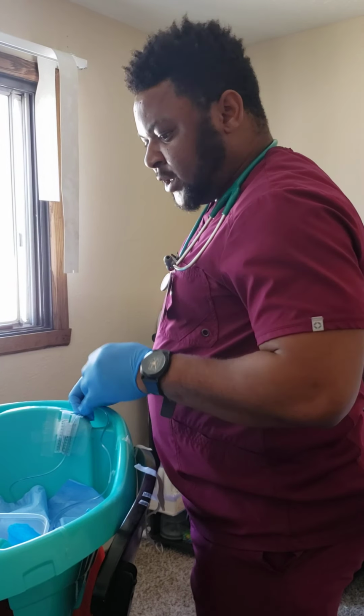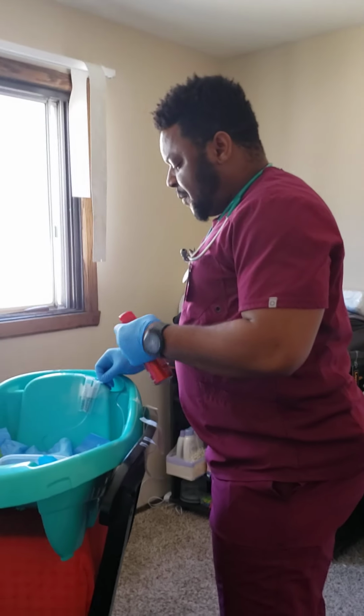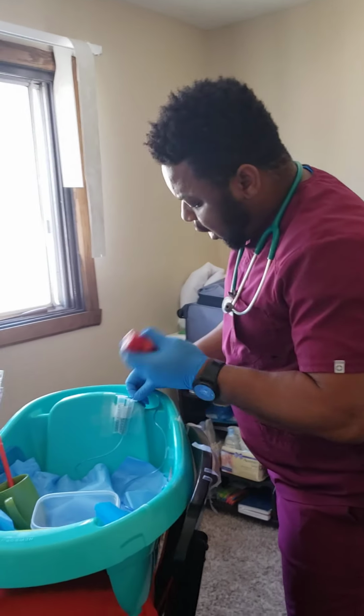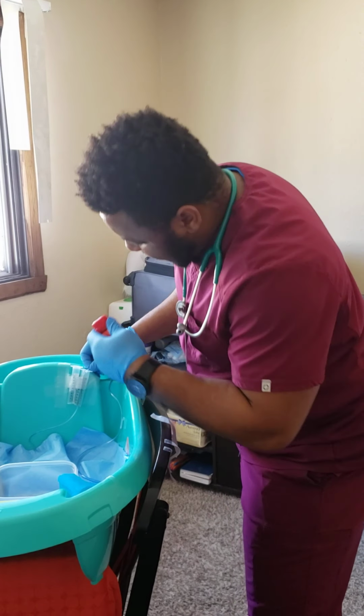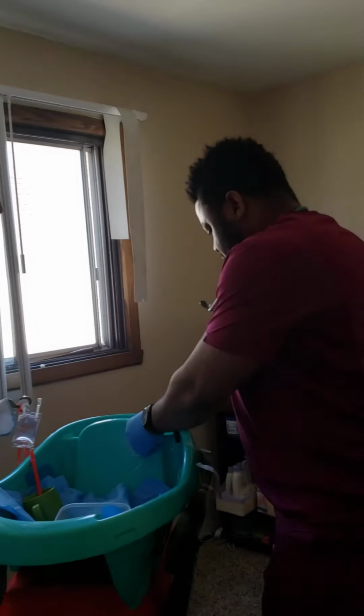When I stop, I take my pen light. I will then open my patient's mouth and look to see if there is any coiling in the patient's mouth. I can see that there is no coiling. I'll put it right there.